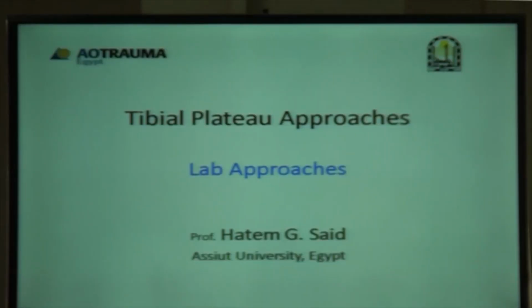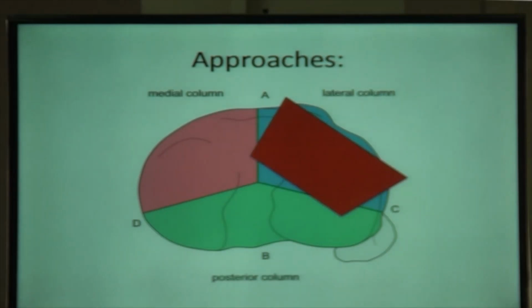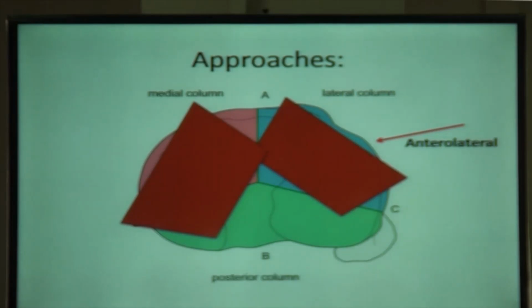So if you look at your screens, please remember yesterday we talked about the plateau, how you're always evaluating the axial view, how the anterolateral approach gives us access to most of the anterolateral side. So we have the anterolateral. We're gonna do the extended anterolateral after the anterolateral, and then we're gonna do the medial approach, and you're gonna see how much you can access through that.